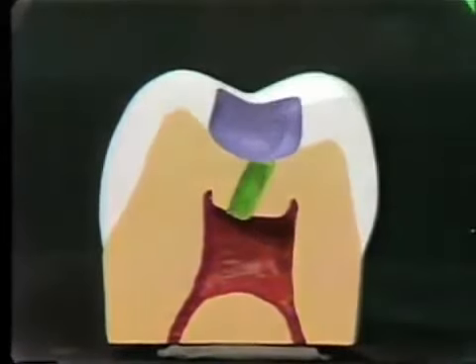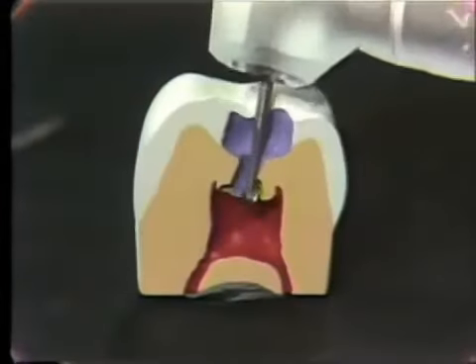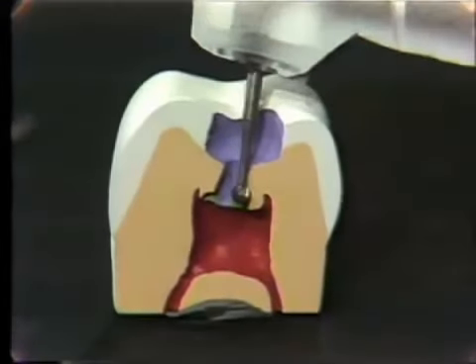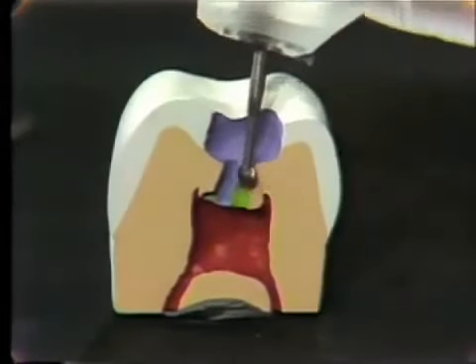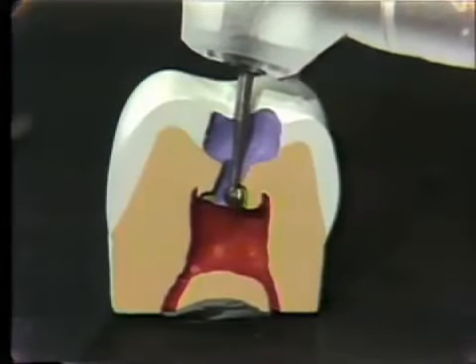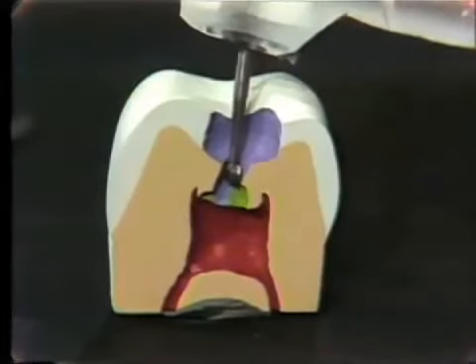Okay, you feel for the roof. You come on down and unroof that tooth, working from the inside out, staying away from the floor and the walls of the pulp chamber. You don't want to look for the canals right now. You wait until the pulp chamber is completely unroofed and then look for the canals.